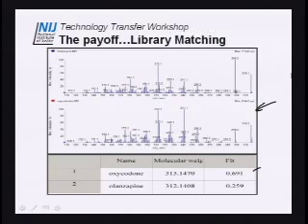I know it's in the right place in my chromatogram because the relative retention time matters, and it triggered the correct MRM transition. I now can go to quantitate that thing, and I've got my 2 pieces of data. I'm going to walk to court and say this person was under the influence of oxycodone. Or in her case, this person had an overdose of oxycodone. Only the medical examiner gets to write overdose. She just says a lot. And that is what we did to build a method.